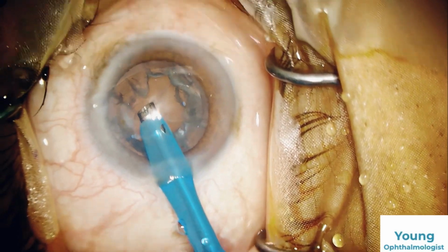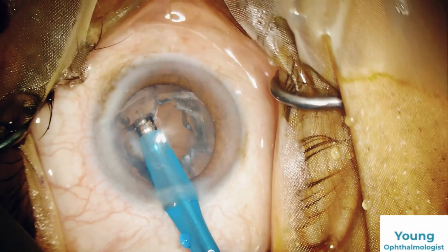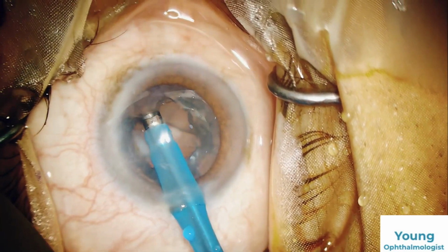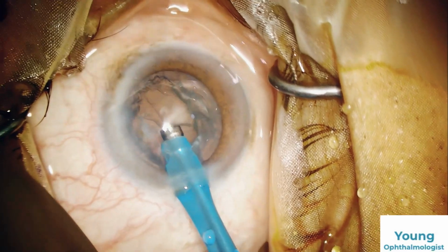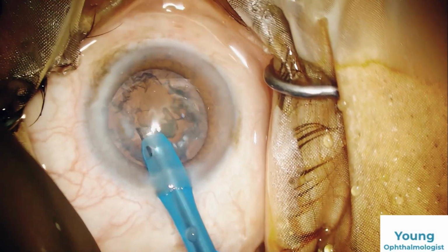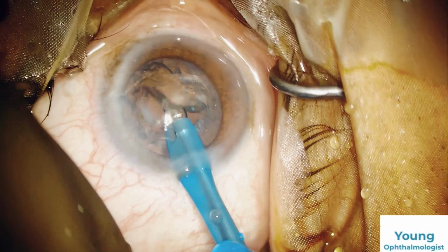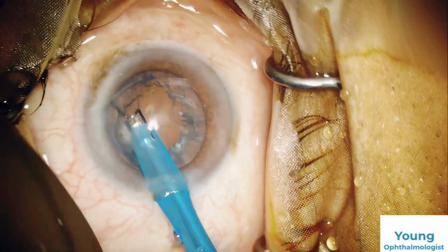Shifting to Phaco 3 with a vacuum of 200, power of 25 and flow rate of 30. A part of epinucleus is aspirated. Still we have a lot of cortex and epinucleus in the back.